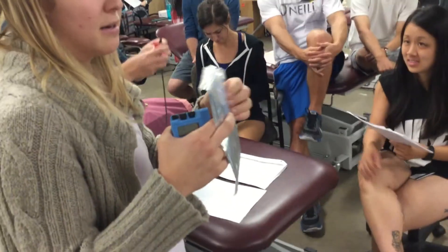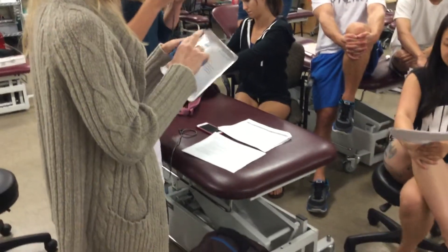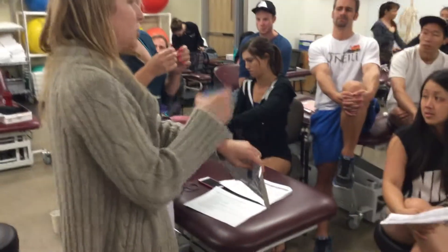For our purposes, you'll put the saline in there, but that would be where you put the medicine. There's another pad in there — it's brown on the application part — and that's going to help push the medicine in.